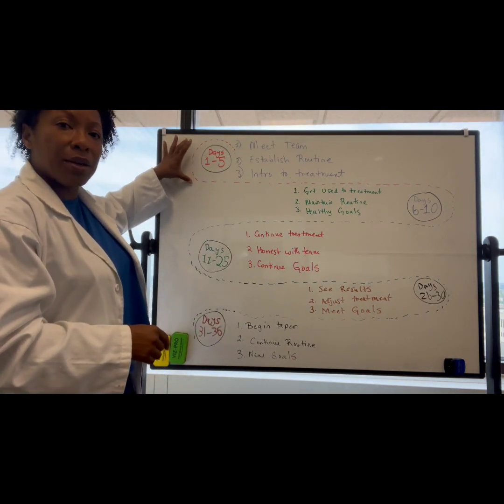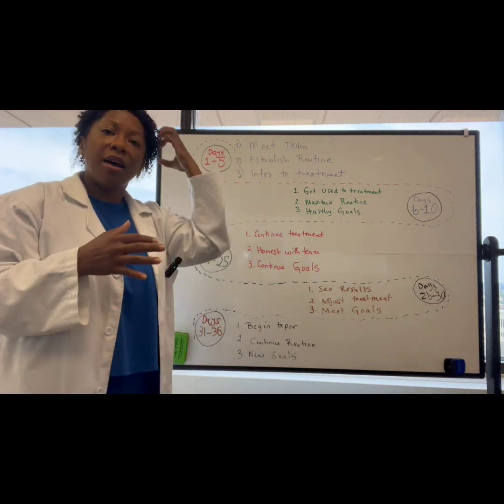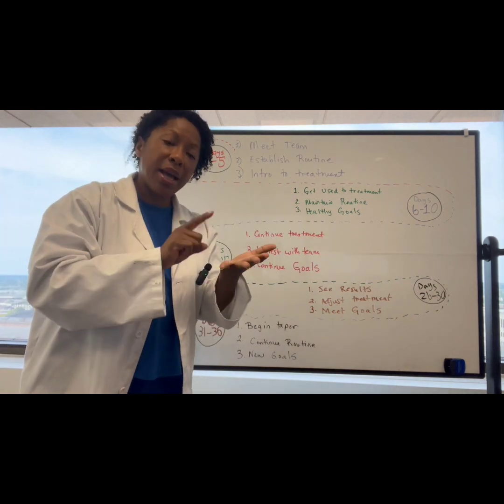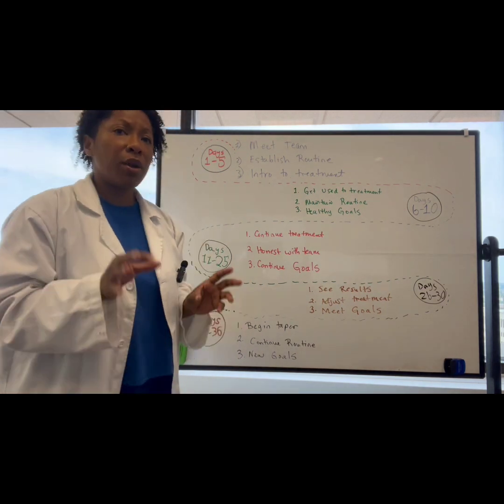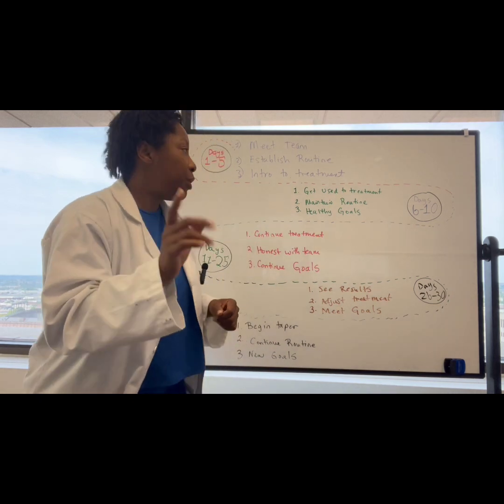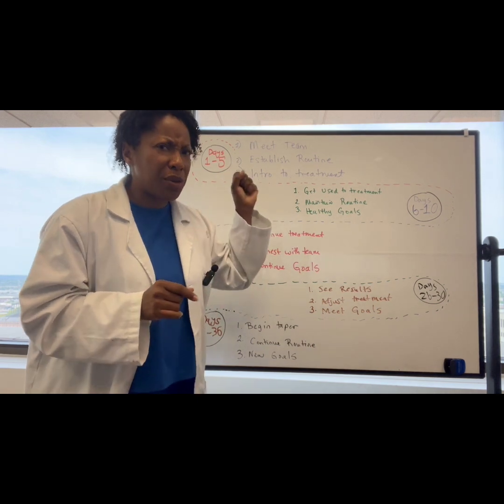During this time, if we're having difficulties getting you acclimated, this is where we're doing a lot of adjustment of the device, of the frequency that's used. In some cases, that's how fast the pulse taps, or the intensity of the pulse based on your comfort level. So when people say, oh, TMS was uncomfortable and I couldn't tolerate it, that's a problem. I need you to tell us, preferably in those first couple of days, but definitely by this next period of time, because some people say, oh, I could tough it out, it's fine.